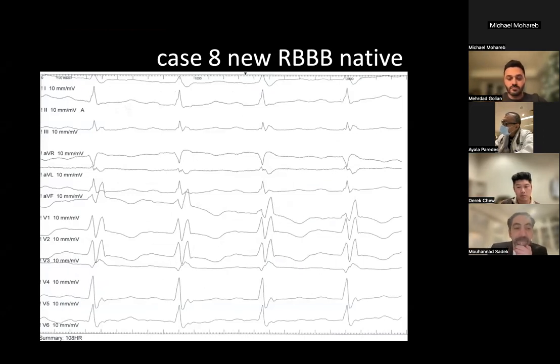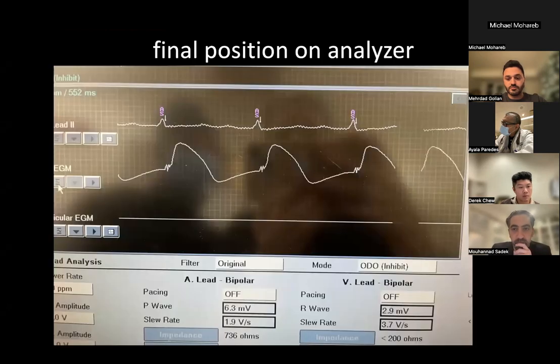Anyway, if you go to the next one, we ended up getting another position that I thought was really favorable. The LVAT was stable, I think 72 and 76 milliseconds. The QRS was nice and narrow. I got an R prime that was very, very tiny, but again, I don't know how much of that was because of her right bundle.